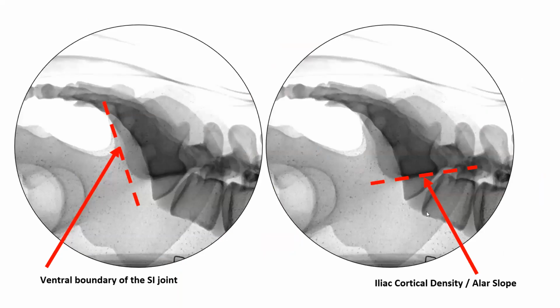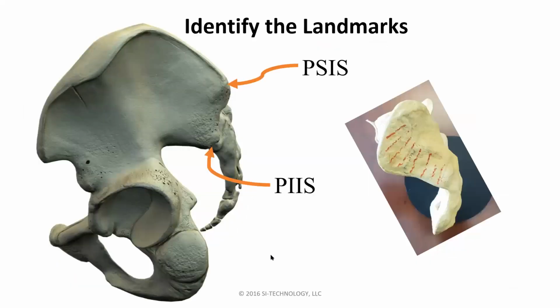Under X-ray, there's the typical view of the lateral sacrum, but you can see that the actual articular portion of the joint extends more anteriorly than you typically see. And this will be better demonstrated on this anatomic model. And you can see the articular cartilage on the lateral view has the red lines on it compared to the extra-articular portion of the joint, which is more dorsal. And again, it's below the PSIS and above the posterior inferior iliac spine or the sciatic notch.